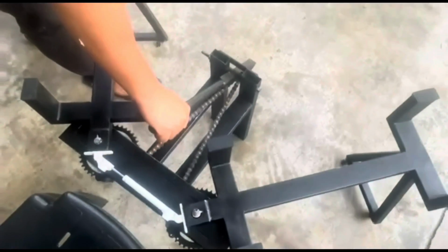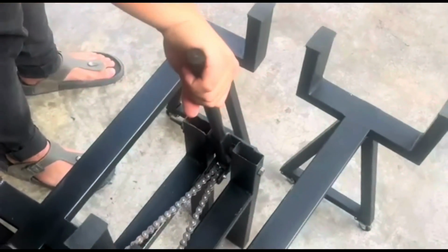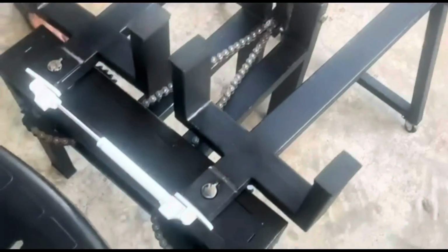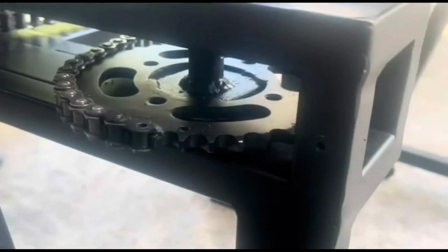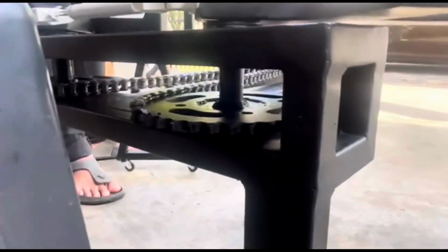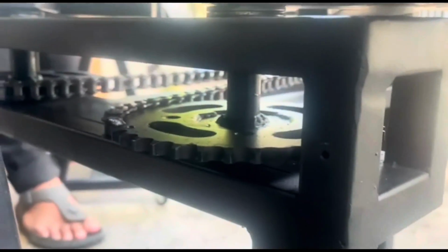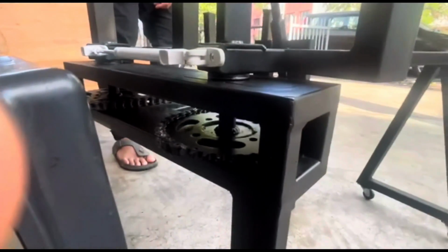As you can see, at the top of the shaft there is a lock built in because we want to make the leg part removable from the base part. And then the sprocket has been connected to the shaft by welding, and the shaft goes through the leg pad to make the leg pad also rotate.